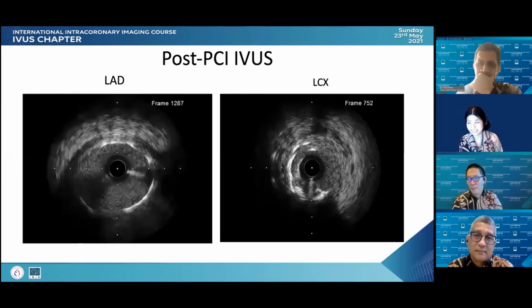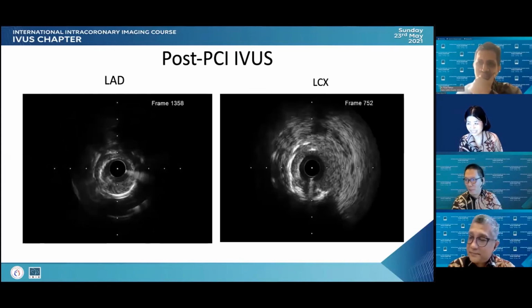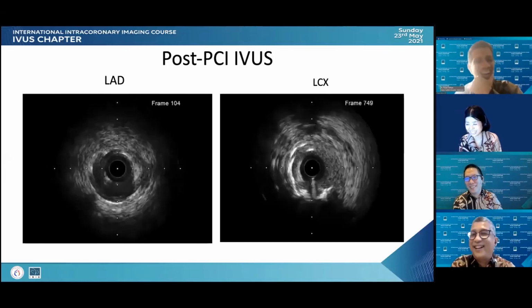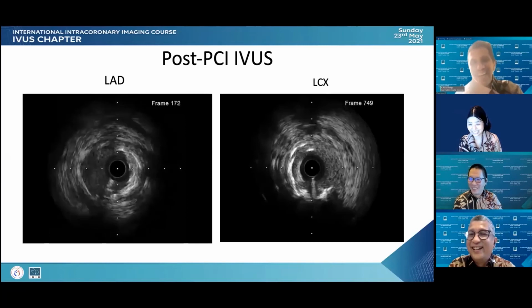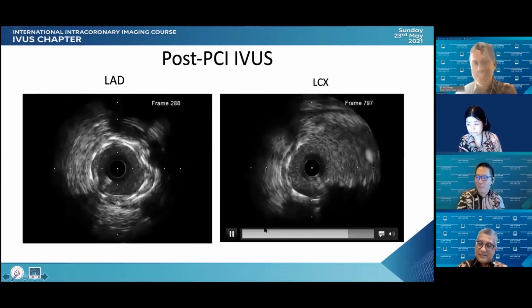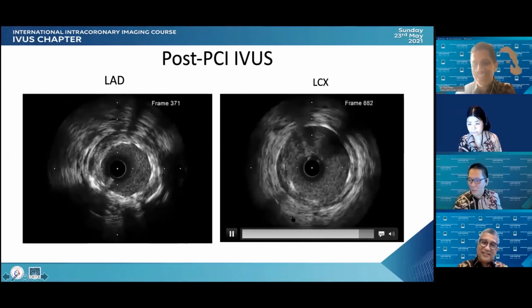I'm so pleased. Fauzi, you have to put the OCT on again for this kind of technique. Okay. So, yes. We have short time for discussion in this case. Fauzi, can you wrap up?